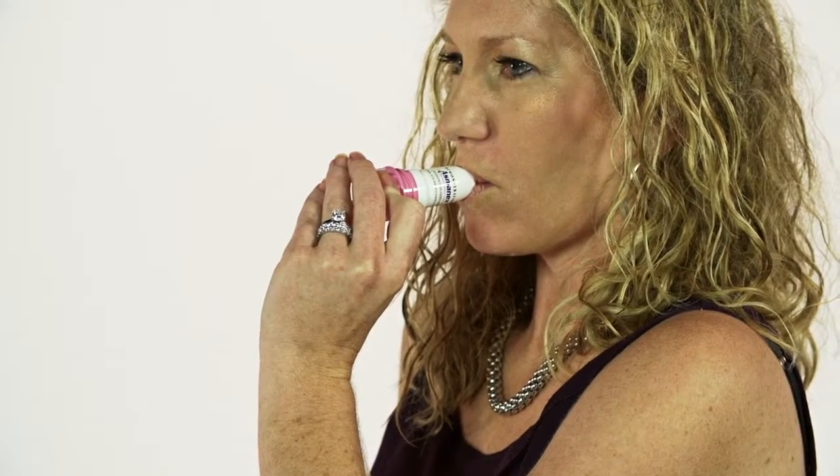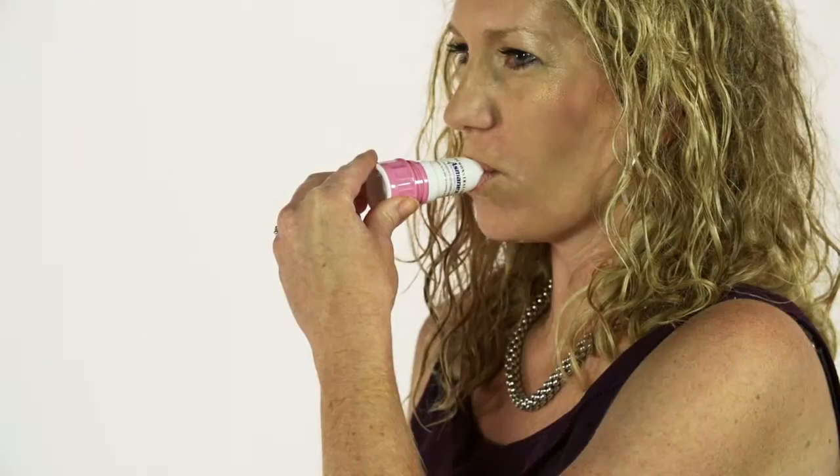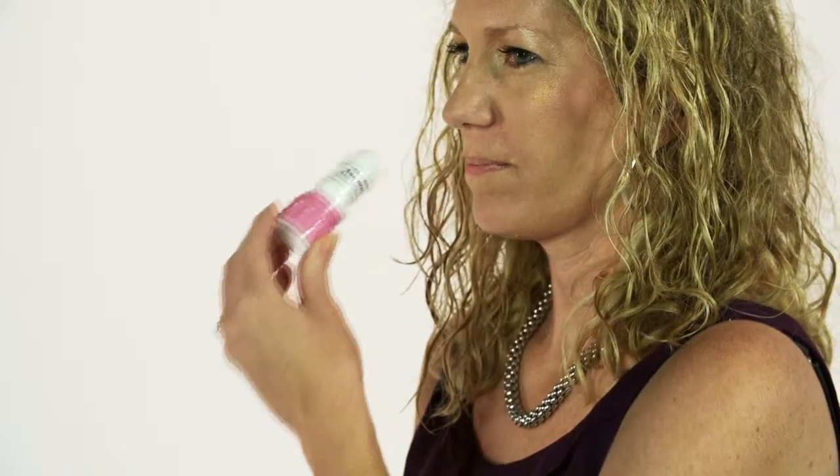Create a tight seal with the lips around the mouthpiece. Inhale fast and deep over 2 to 4 seconds. The speed and deepness of the breath is like that of the discus.